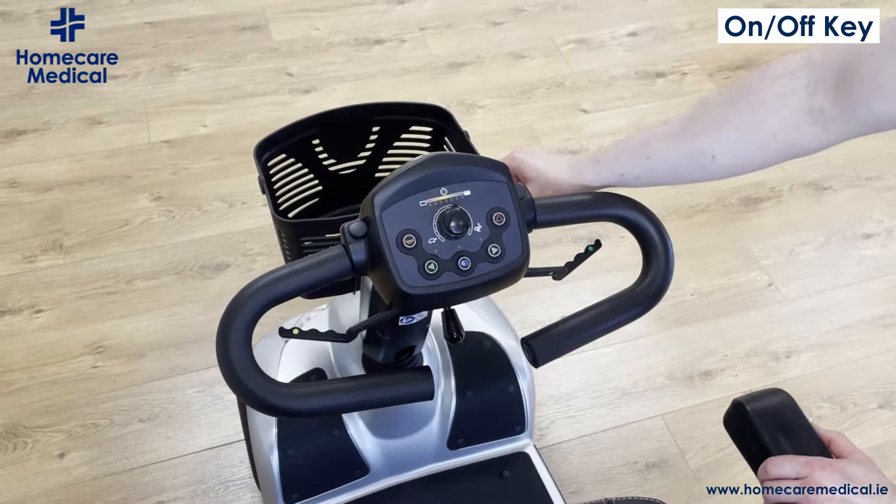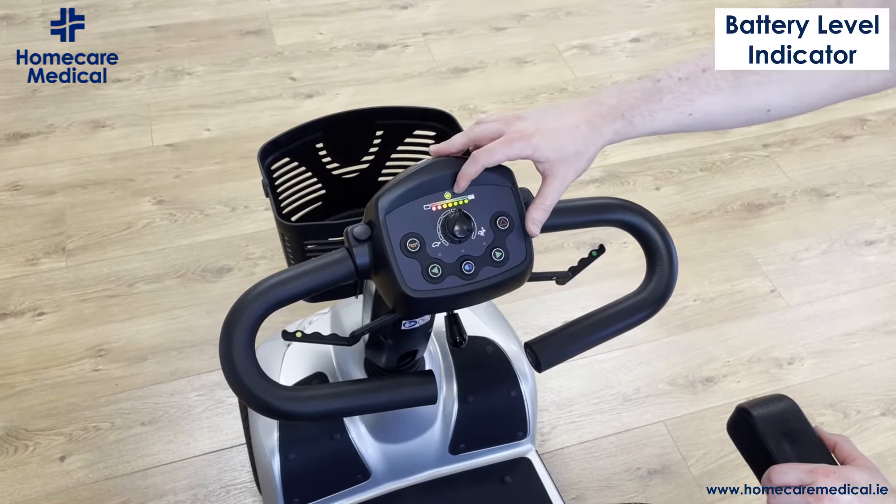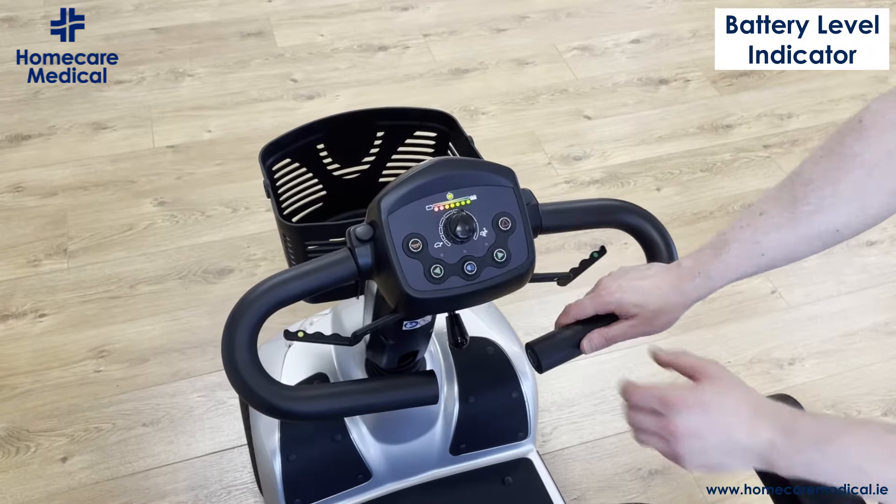To operate the Leo scooter, the key is on the right hand side. You power it on and you can see your battery level indicator here on the top.